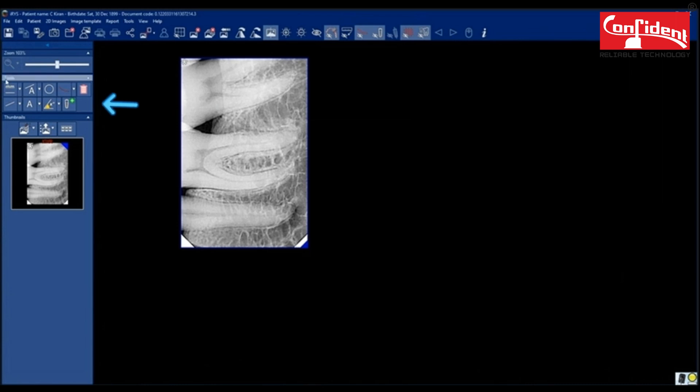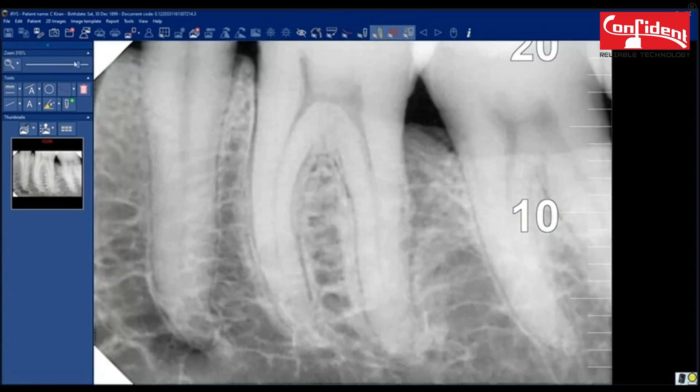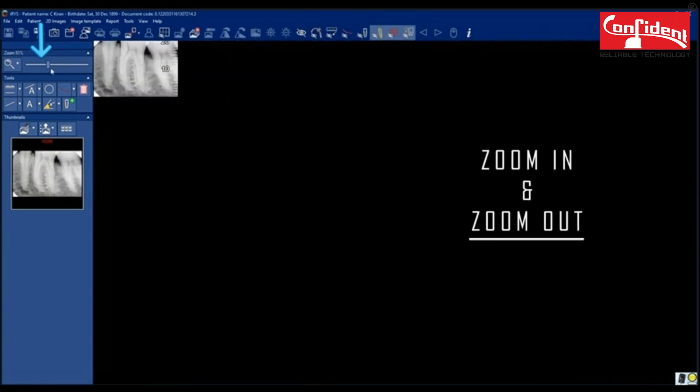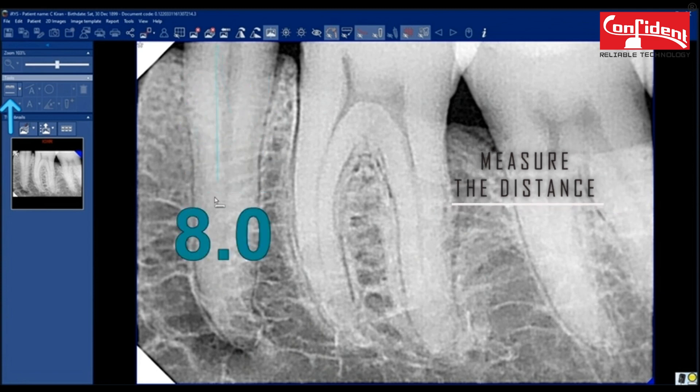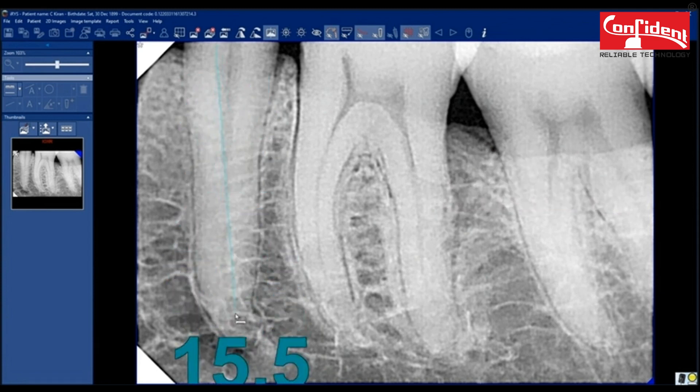Edit the image using these tools. Zoom in and zoom out. Use scale tool to measure the distance between points.